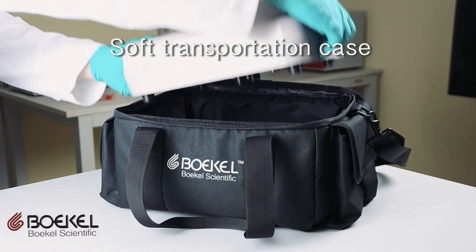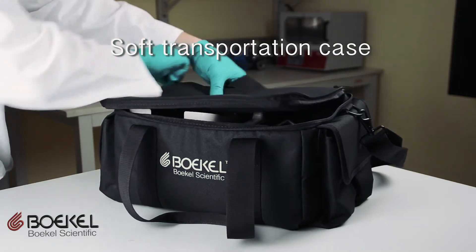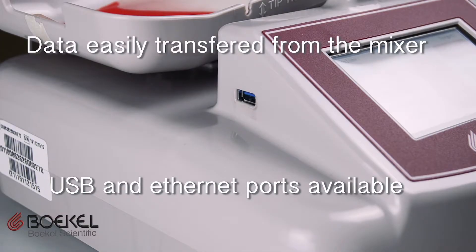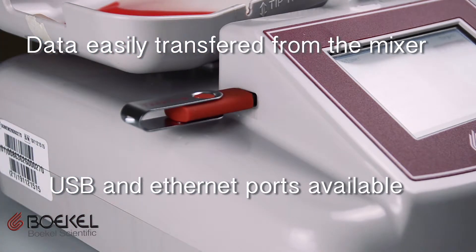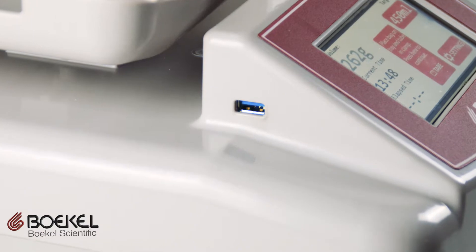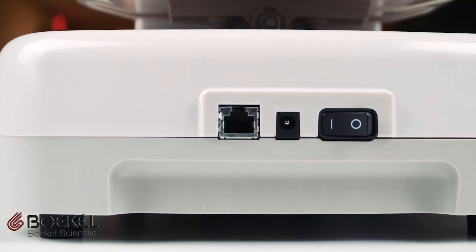And when you're all finished, the mixer can be packed up into its transport soft case. The data collected from the mixer can also easily be transferred back to your software system through either a USB download or a wired connection. The USB port is conveniently located on the side of the screen.